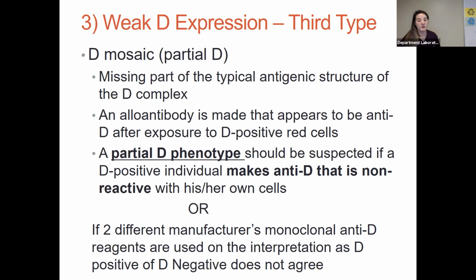If you suspect that, you might want to use a different manufacturer's monoclonal anti-D. Remember, monoclonal because it is specific for a specific epitope. All right, so if you use a different manufacturer, you might be able to get different reactions.